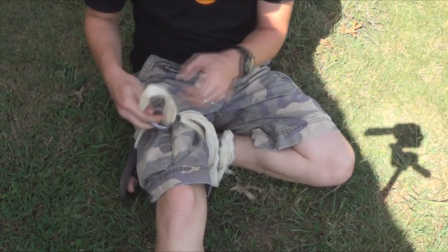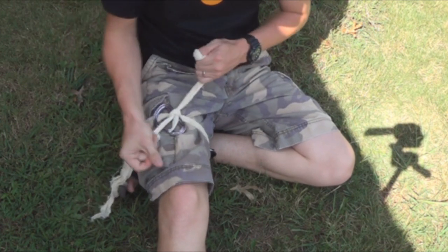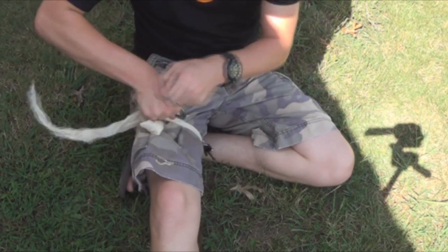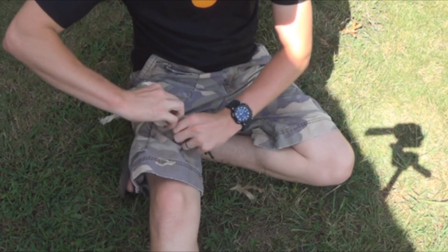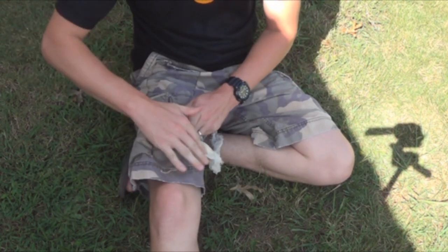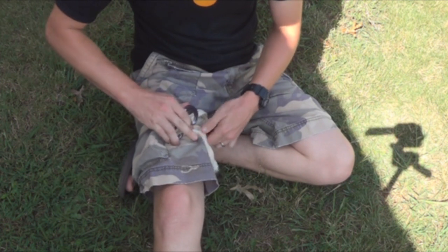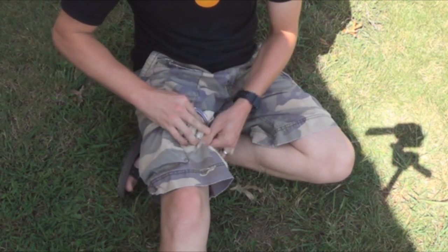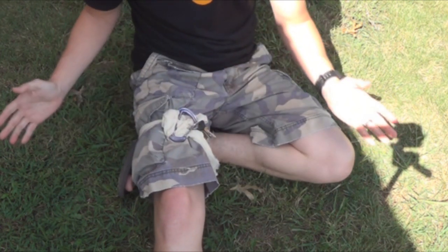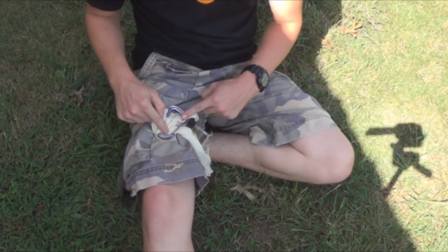Bring your carabiner in and do another overhand knot. This is where you are going to use it to tighten. You would want to tighten this until blood flow has stopped, so the massive hemorrhaging has come to a complete stop. Then bring your key chain around and lock it into place so the key chain itself is holding the carabiner so it doesn't unwind.